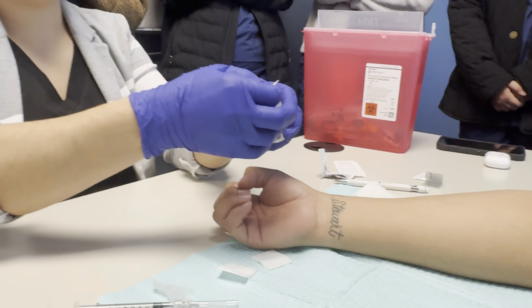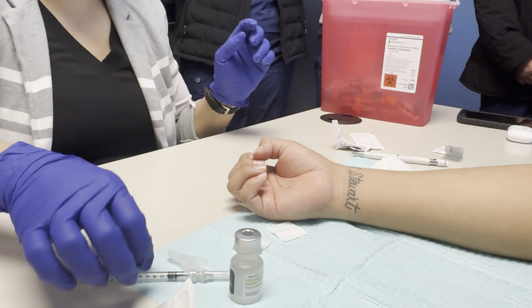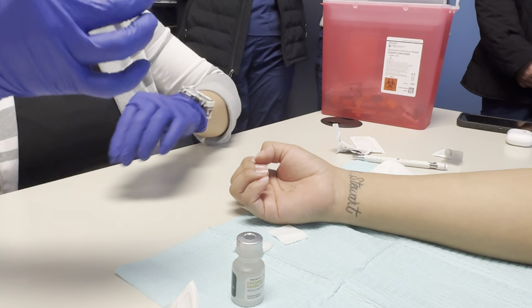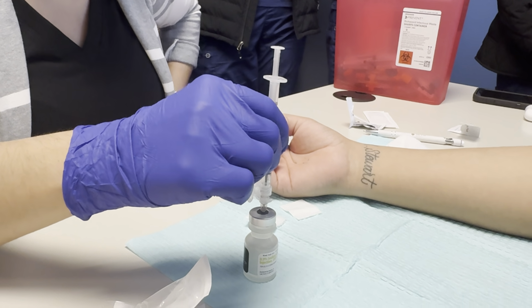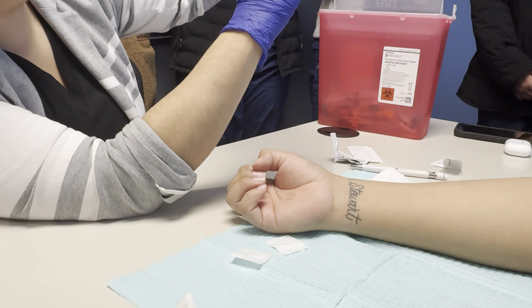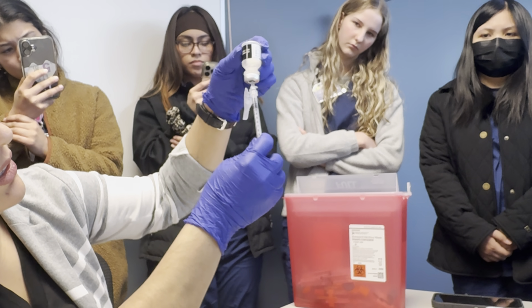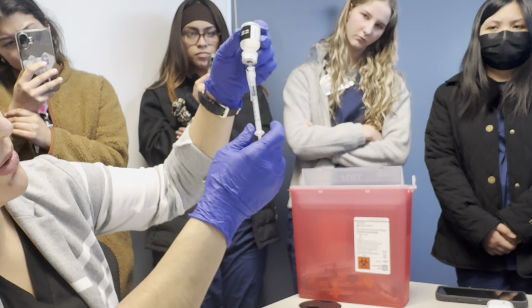Gonna clean my vial, put my vial down, and then I'm gonna go ahead like a princess, open up my needle, turn it down, single hand, and inject that air into the vial. And I'm gonna pull my plunger back, making sure there's no bubbles. You see that I'm passing my limit right now, right?